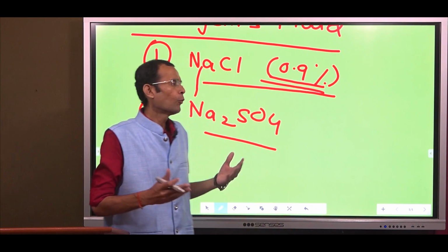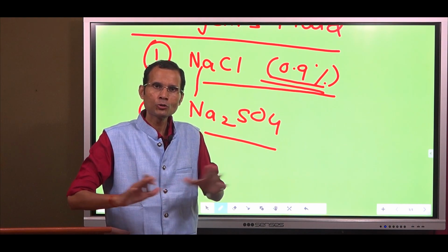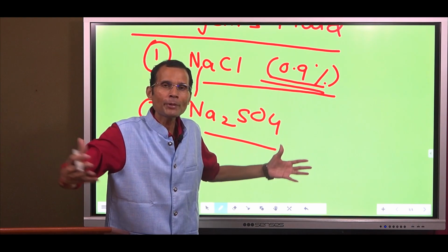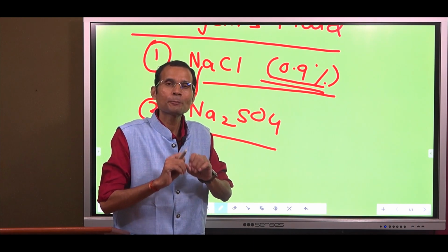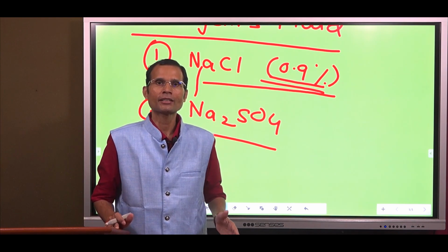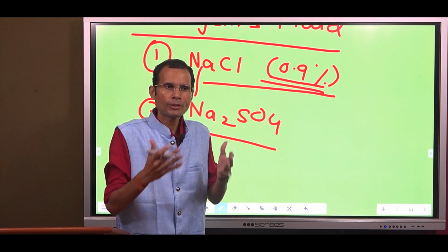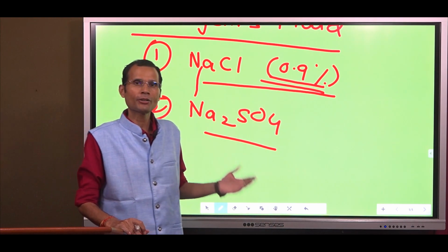Why is that? Well, if the dilution is too much for the blood sample, the clotting factors present in that sample will not be able to come together and form a clot. They are dispersed, just like the cells get dispersed. Even the clotting factors will get diluted too much, and therefore clot formation will not occur. So you don't really need the anticoagulant.